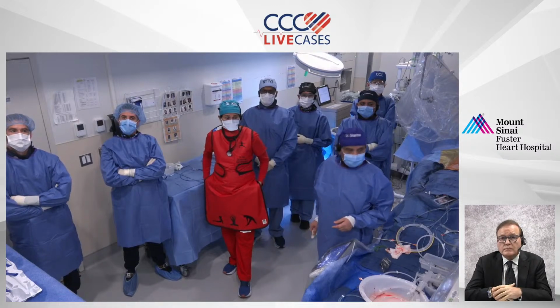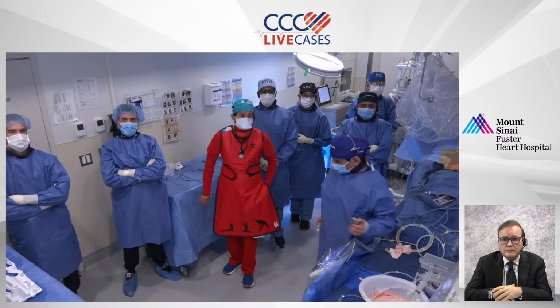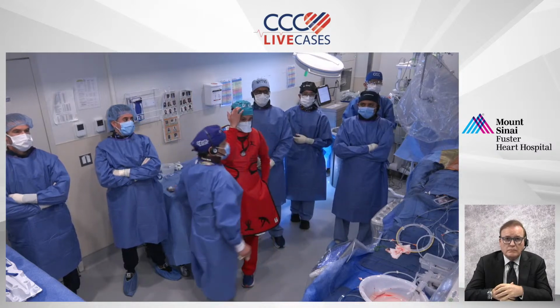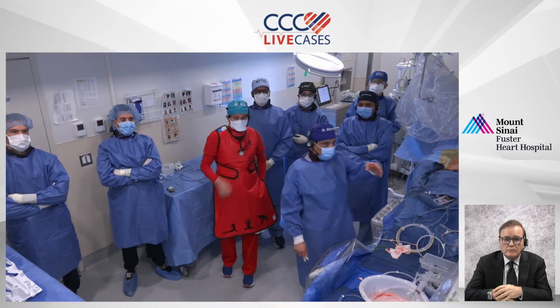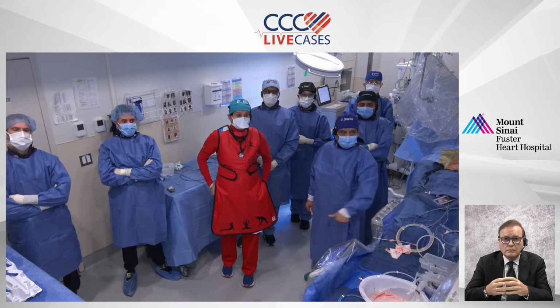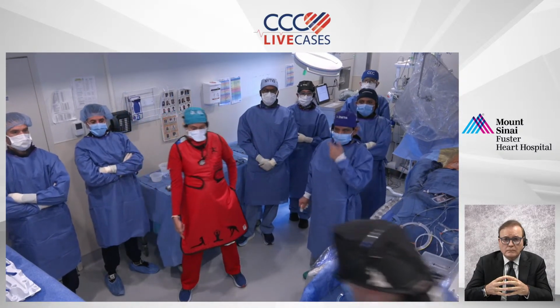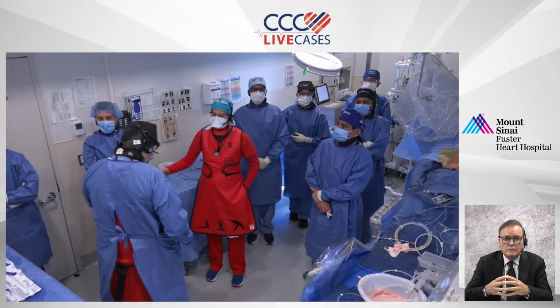Yes, that's a great question. On the short axis view, you can planimetry the area of each PVL, and there are guidelines. If it's less than 10% it is mild, if it's 10 to 30% it is moderate, and more than 30% is severe.